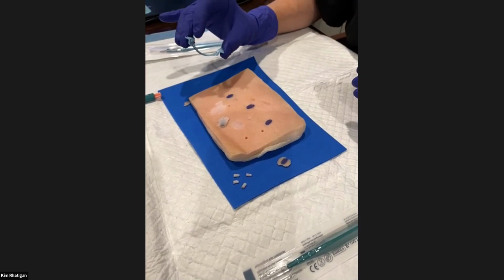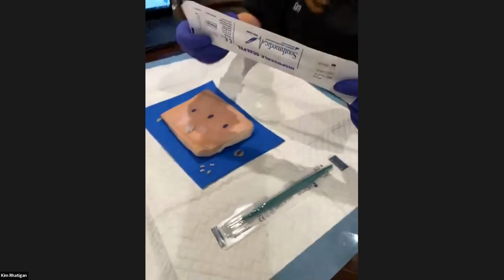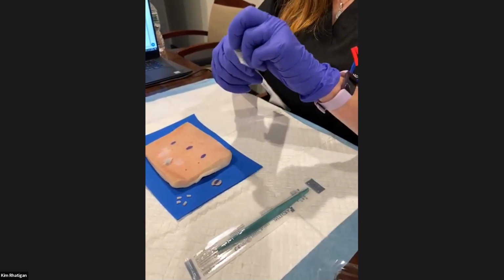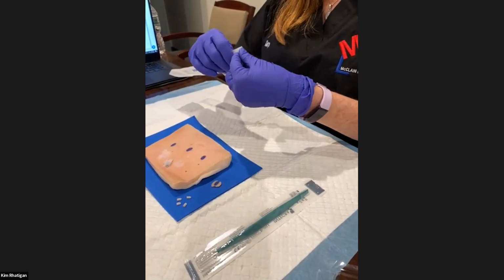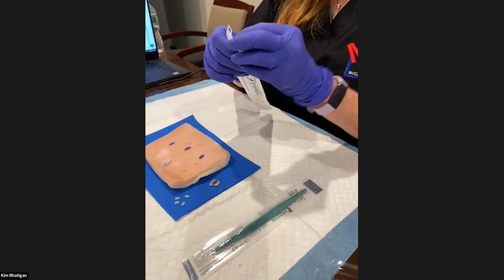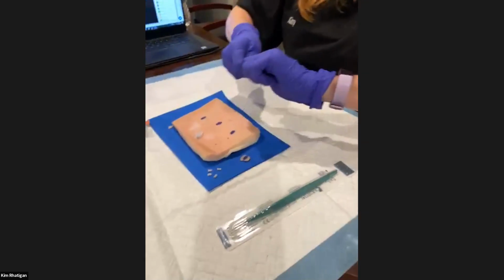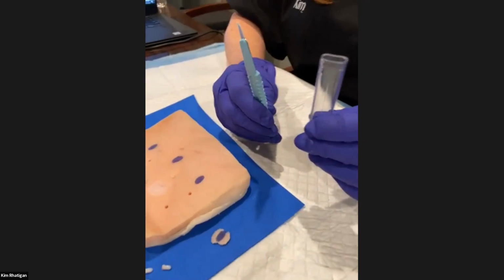Anyway, let's go on to another tool, the scalpel. You can do the same shave biopsy with a scalpel. Now, one thing you can practice with this pig skin, we didn't include any sutures, but you can practice making an excision and then practice your suturing on the pig skin. The pig skin is a very useful material to work with, and you can practice your surgical skills.